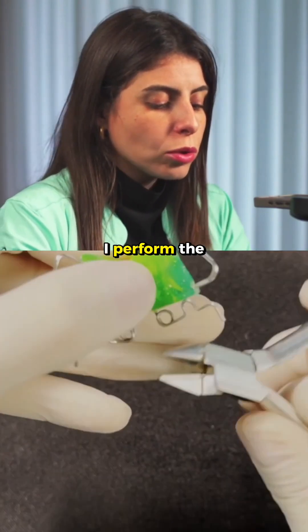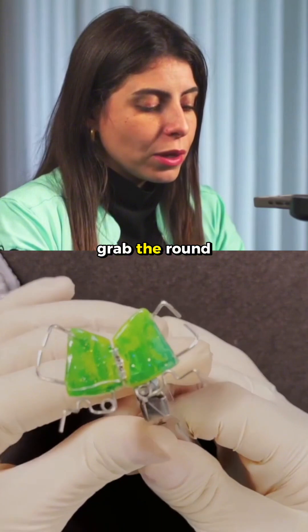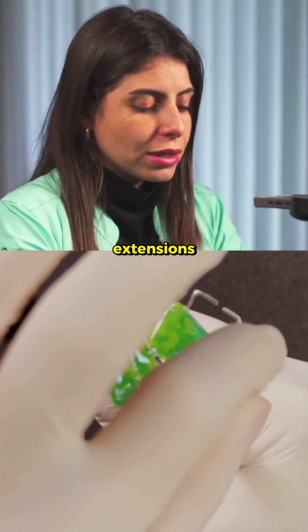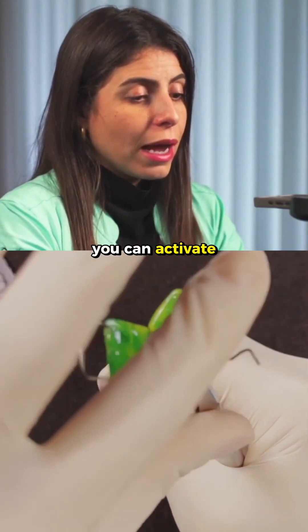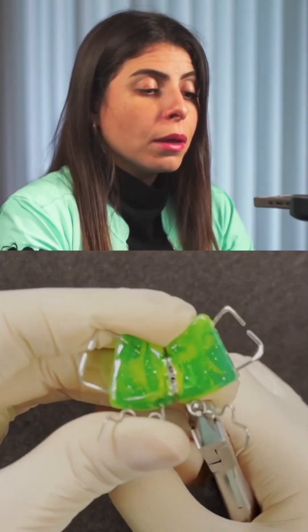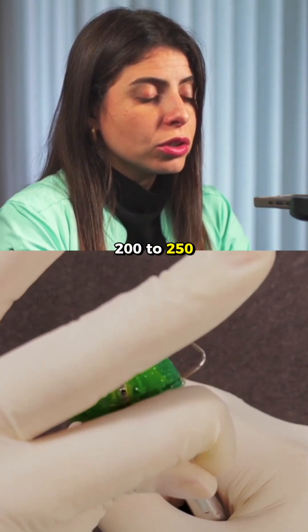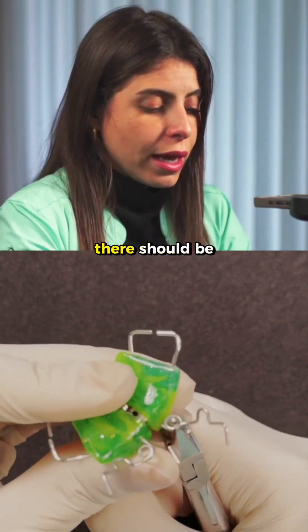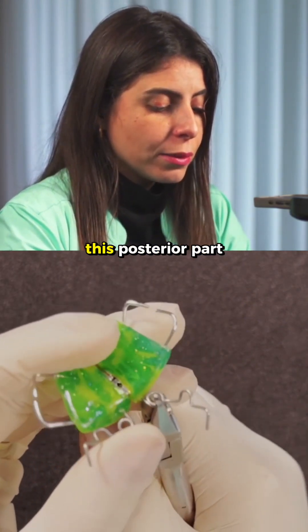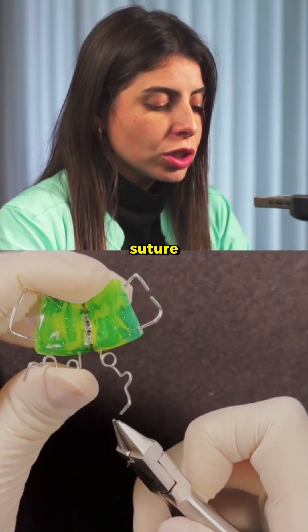So how do I perform the activation? With bird beak pliers, grab the round part of these extensions, and that way you can activate it in the direction of the mid-palatal suture. Ideally, there should be an activation of 200 to 250 grams, and it's also ideal to keep this posterior part parallel to the mid-palatal suture.